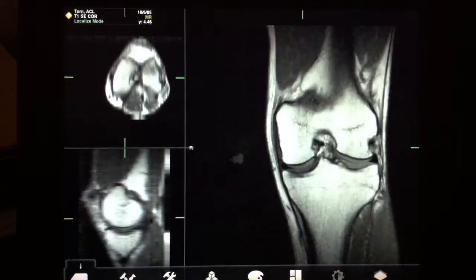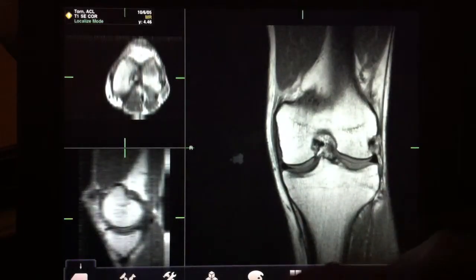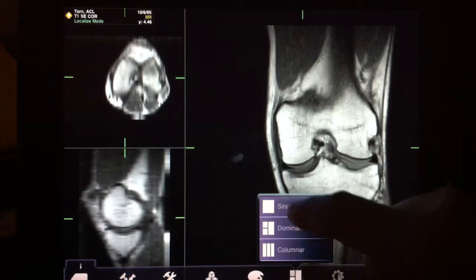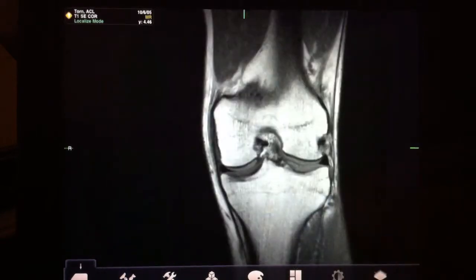Tap on this ACL MRI study. It takes a second to load, but after that you'll see that the interface is incredibly fluid.